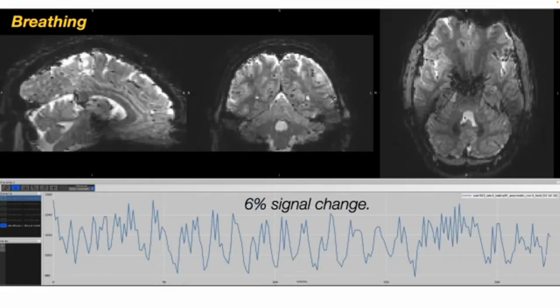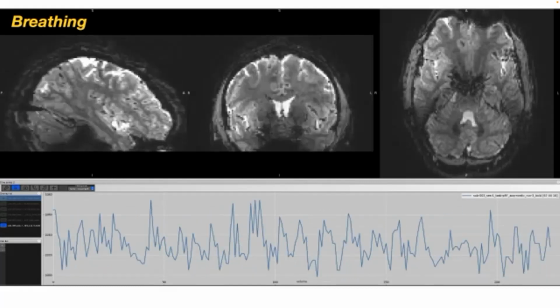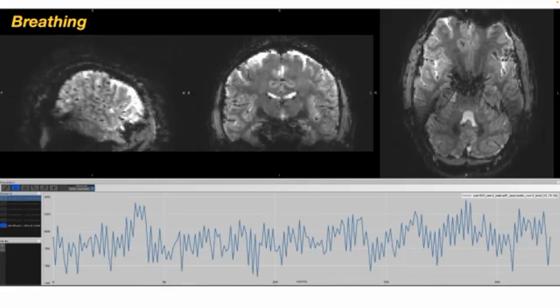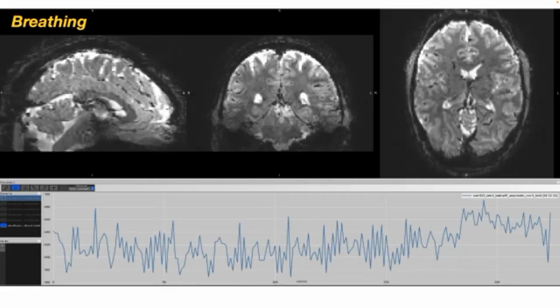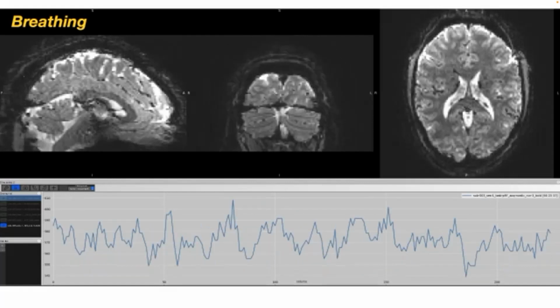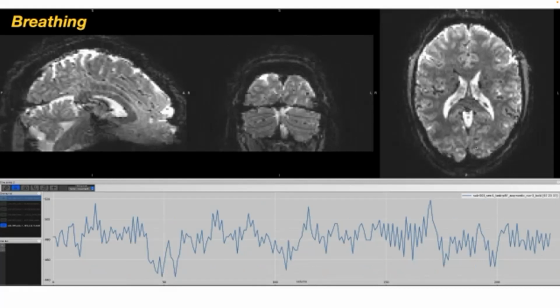Oh yeah, so here's the breathing response. So you see these fluctuations? That's me breathing. Right, so you see not only the heartbeat, but also the breathing gives you these signals that you're not interested in. Now I was looking for a very specific response here. Just clicking around the brain, I only see noise, right? It's breathing, it might be movement, it might be whatever.